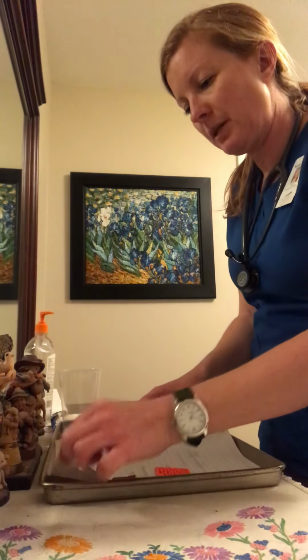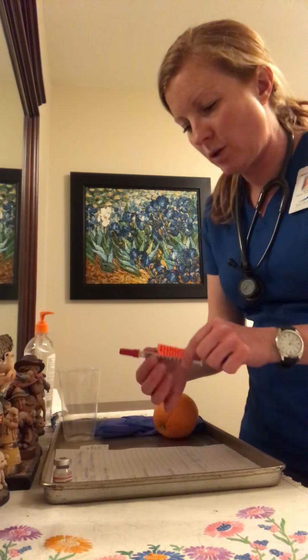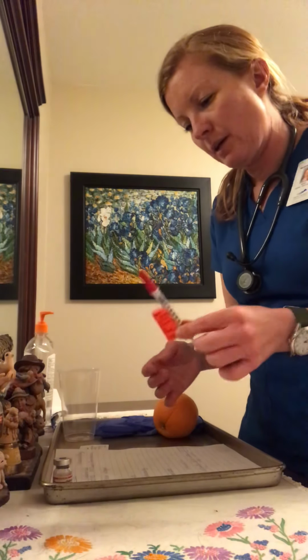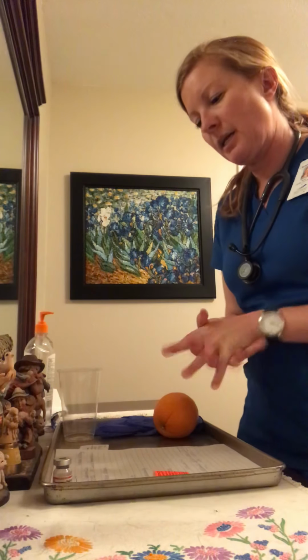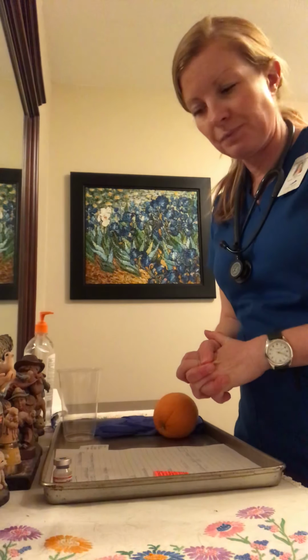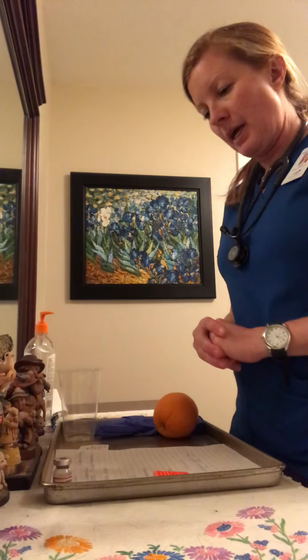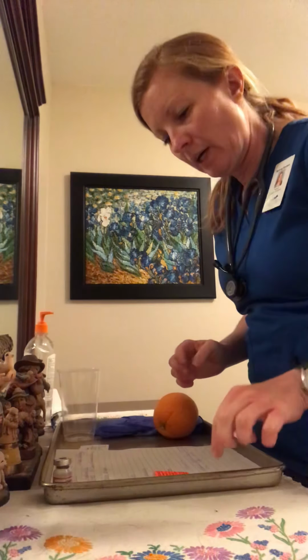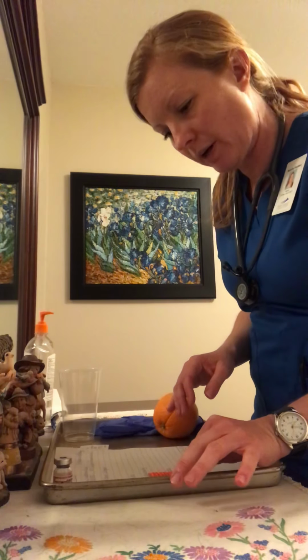So I'm going to explain to the patient what we're doing or what I'm giving, the procedure. So today I am going to be giving you your heparin. Heparin is an anticoagulant, it's a blood thinner, and this would be used because of your diagnosis of deep vein thrombosis. So I will do that. And then I'm going to do my final 6 rights to make sure everything is correct.